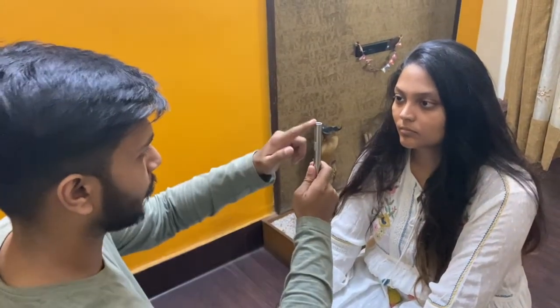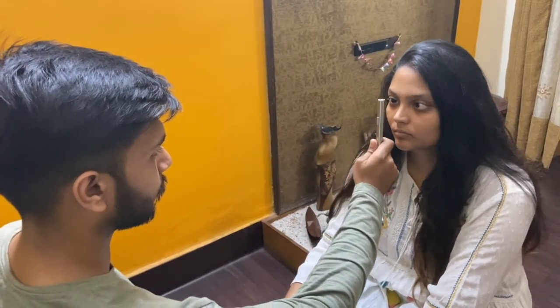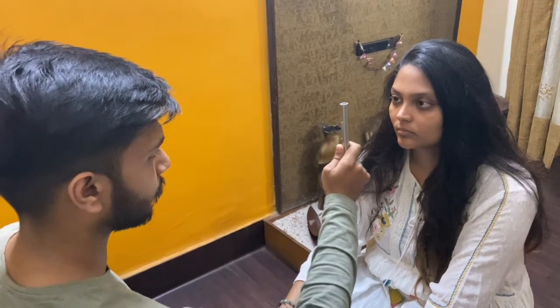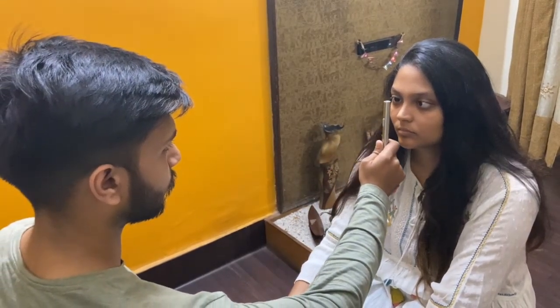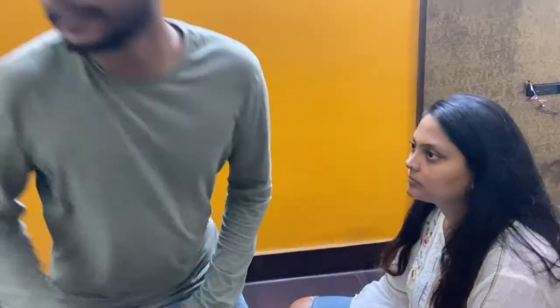For convergence, I ask my patient to look at my pen and follow it as I move it towards the bridge of the nose. For the red-orange reflex, I use my pen light as an ophthalmoscope. So, you have to hold your ophthalmoscope with your right hand and turn to zero diopter. Examine the patient's right eye using your right eye. No opacities blocking the red reflex.